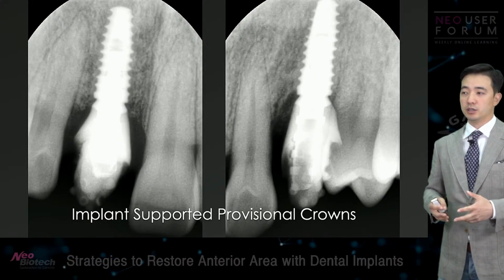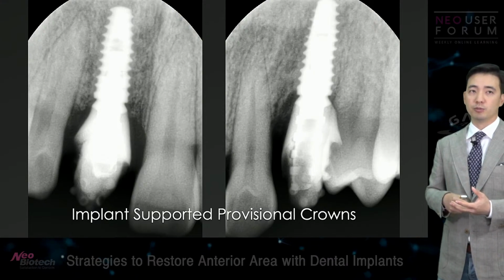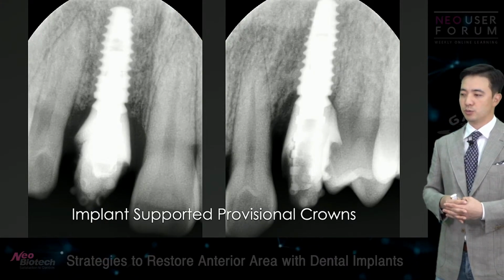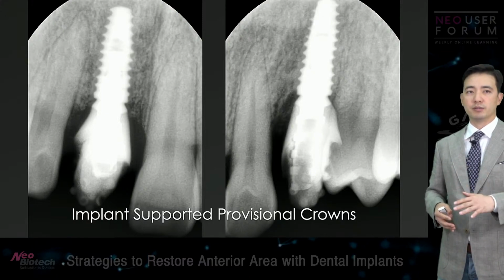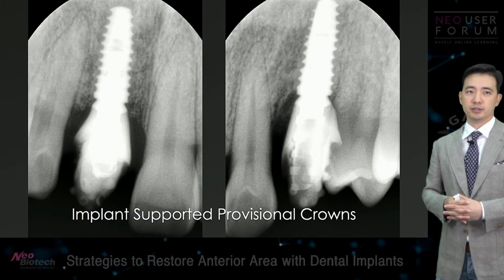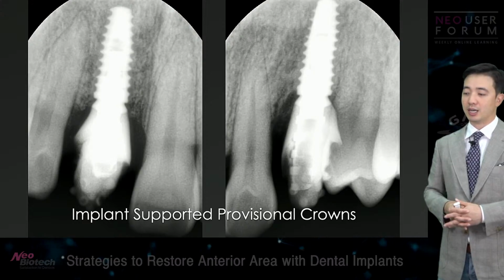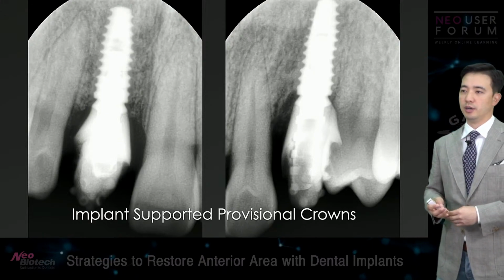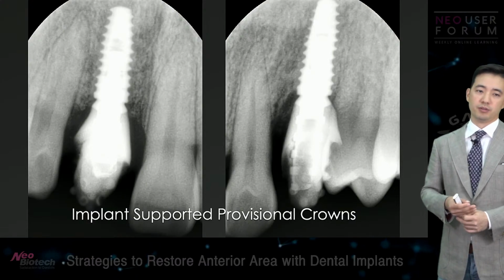Okay, and you know, for number 12, it really worked out well. For 22, it was unfortunate that it had to fail, but even if it did fail, I didn't really do that aggressive of a surgery to recover from that. So I don't think that I have lost that much trying the socket shield technique for that case. Okay.